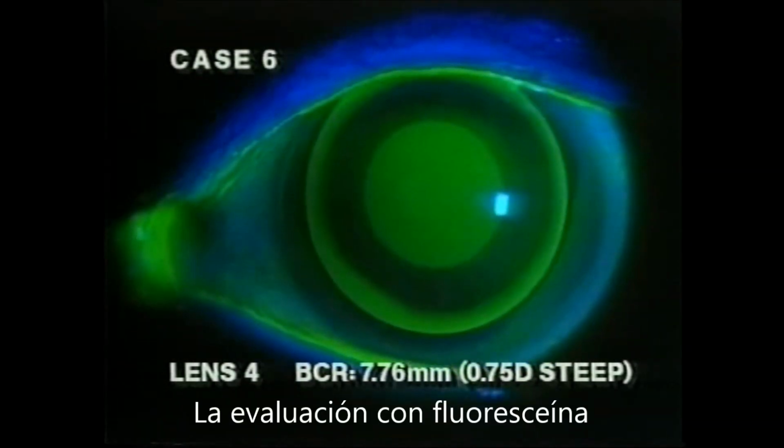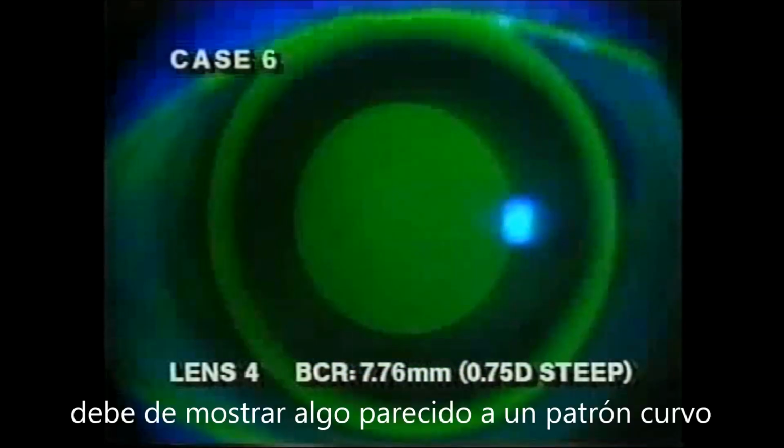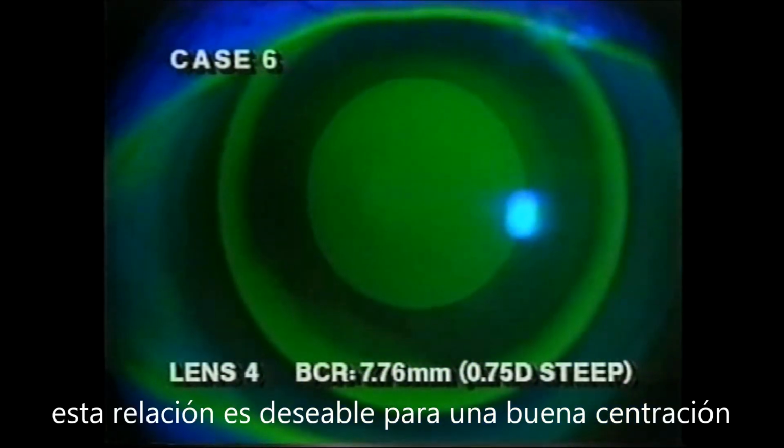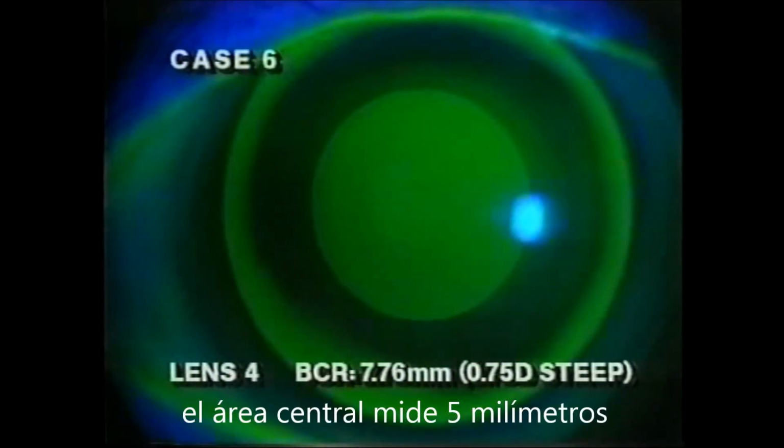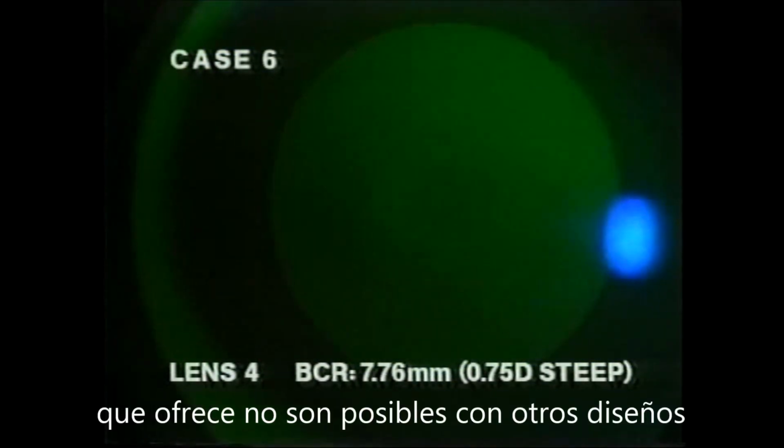Fluorescein evaluation reveals a steep pattern with mild mid-peripheral bearing. This steep fitting relationship is desirable to provide good centration. The central diffraction area is 5 millimeters wide. Individual diffraction zones are more easily seen under high magnification. When this lens becomes available, it should be a viable option whenever use of an alternating design is not possible.